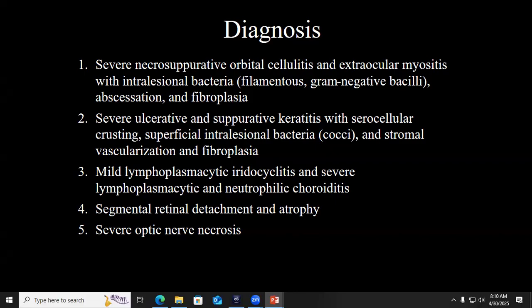So we did kind of wonder, is there oral nasal disease? Is there facial disease elsewhere? And this is just extension of that bacteria into the orbital space. At this stage, just with the information we have, it's a little bit speculative. So they'll have to correlate clinically in this case, but kind of interesting case.